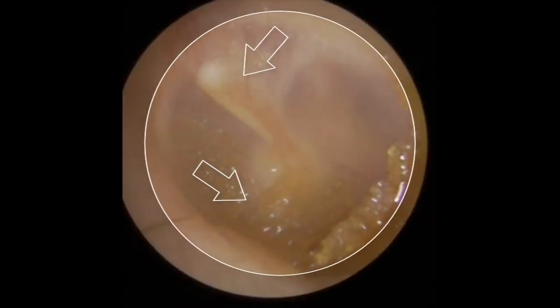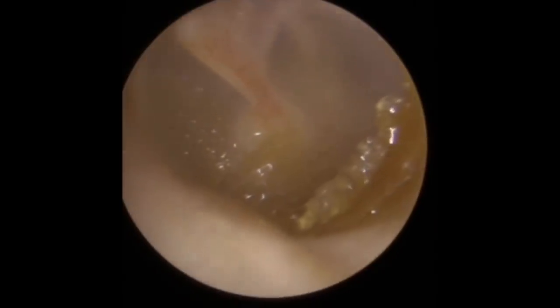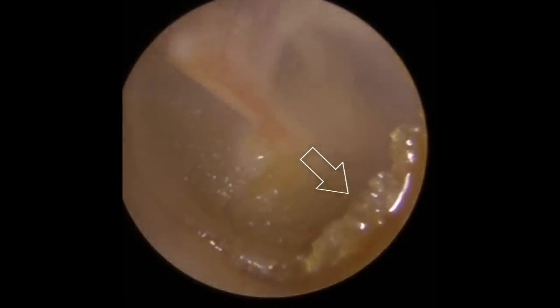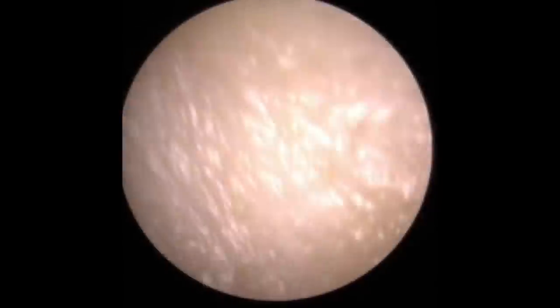So what you can see is we've got the hammer bone, but we're missing a light reflex hook at the bottom. All of that bottom of the eardrum there is covered with a very, very thin layer of wax. You can also see the side of it there lifting up to the right side. This is all one continuous piece covering the bottom of the eardrum. Very thin and very difficult to spot. So this is the reason that patient's been having a little bit of difficulty.